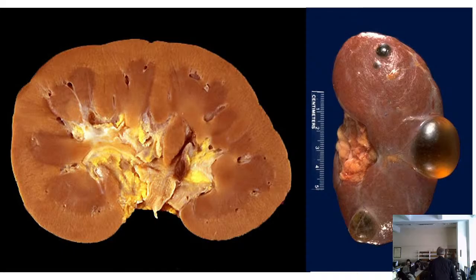Yes, please. In the case of polycystic kidneys, could this be like just... These are single cysts. They are not compatible with the gross image of the polycystic kidney, which we'll see shortly. But it can't be, for example, like the first one. It can't be that big. I think that they develop simultaneously, all of them.